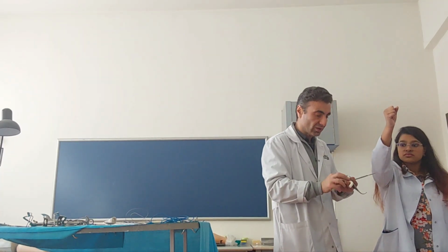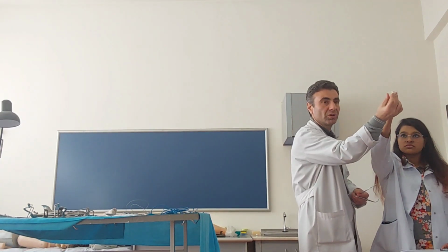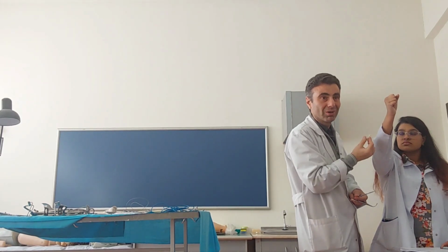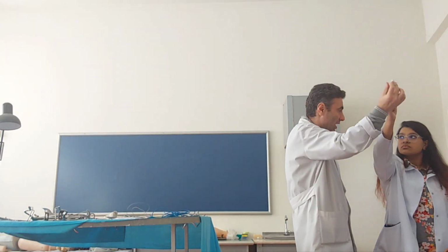For example, this is the larynx, or this is the upper part of the trachea, doesn't matter. Here there is an obstruction. What is my goal now? To open this respiratory system and make a fistula below this obstruction. It would be very stupid to do it above the obstruction, because it will not give any benefit. Anyhow, air will not go down. That's why I must make the stoma only below the obstruction, not above it.